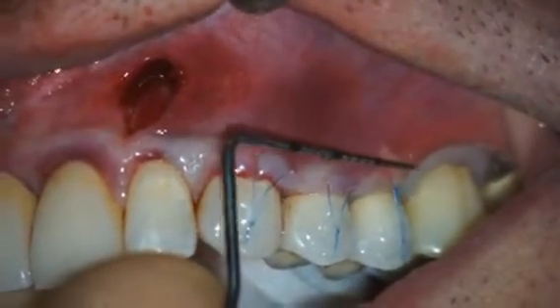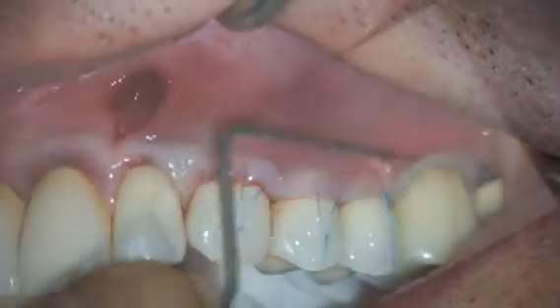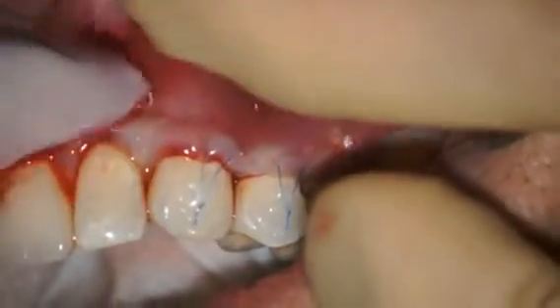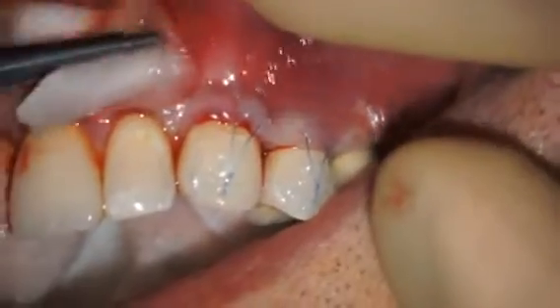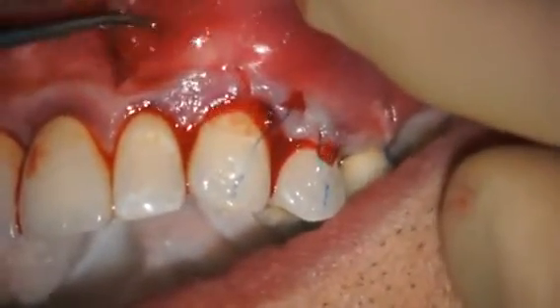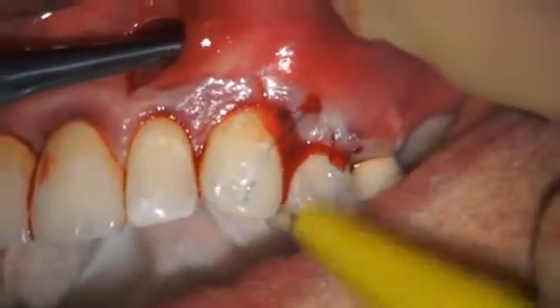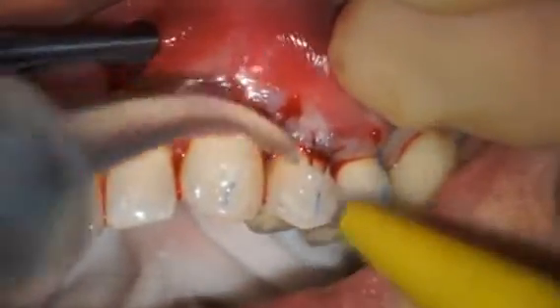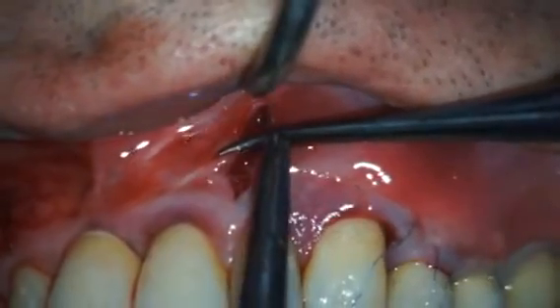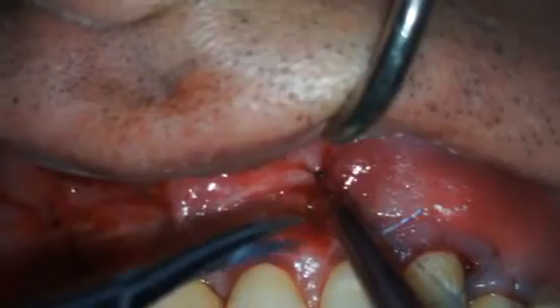Using a periodontal probe, the distance from the maxillary left canine to the distal aspect of the second premolar is measured. A properly sized mucograph matrix is then lightly wetted with sterile saline. Although in other procedures mucograph is positioned dry, in the VISTA tunneling technique lightly wetting the mucograph facilitates smooth placement throughout the length of the tunnel. It is best to wet the mucograph immediately prior to placement. Using a tissue forceps, mucograph is inserted through the vestibular access opening the full length of the subperiosteal tunnel. The compact layer should face upwards and the spongy surface should face toward bone. Mucograph should cover all portions of the exposed roots, and excessive pressure should be avoided as it may compress the matrix. After mucograph comes in contact with blood, there is approximately a one-minute window when its position can be adjusted; beyond one minute the consistency changes and it should no longer be manipulated. Following placement, the midline incision is approximated and sutured primarily with multiple 6-0 polypropylene sutures.